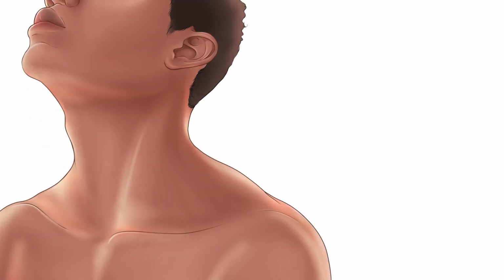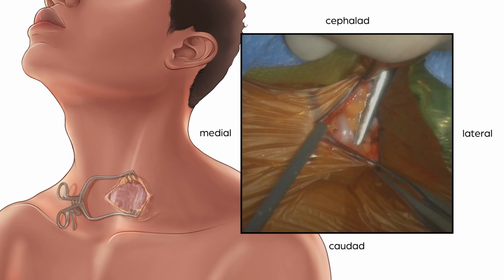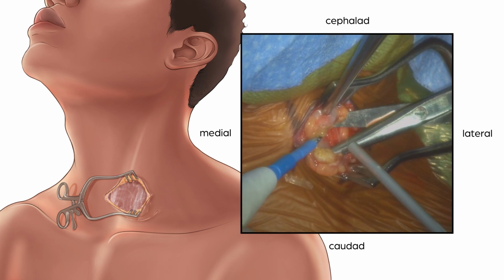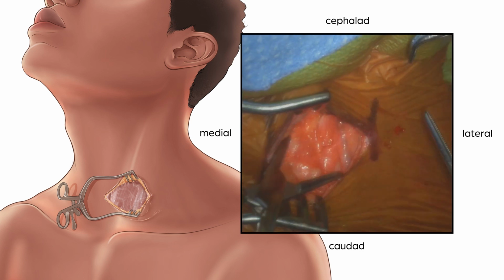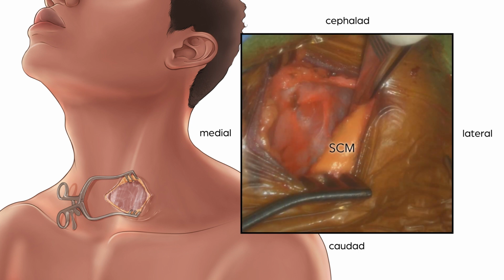The patient is taken to the operating room and placed under general anesthesia. The left side of the neck and chest are prepped. A linear incision is made along the mid-cervical crease. The platysma muscle is divided and undermined. Medial to the sternocleidomastoid muscle, the carotid sheath is identified.